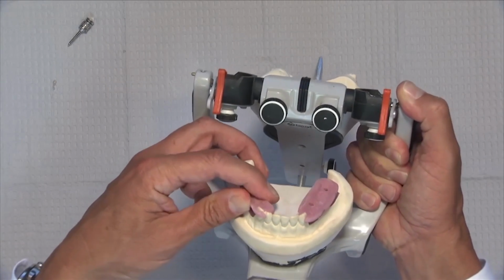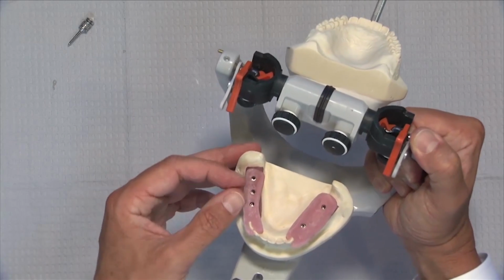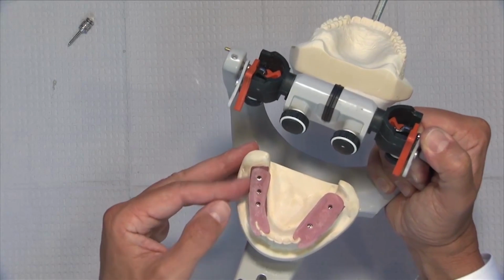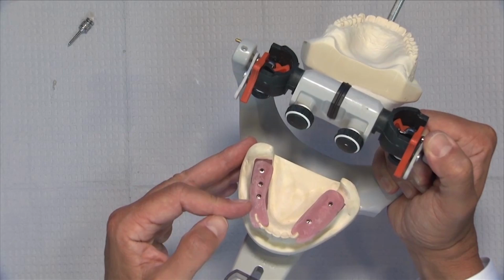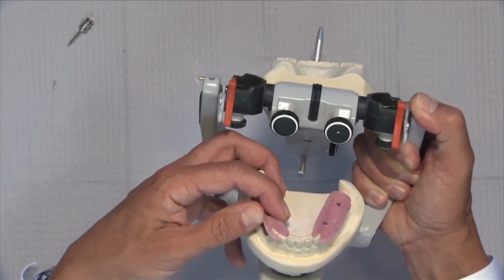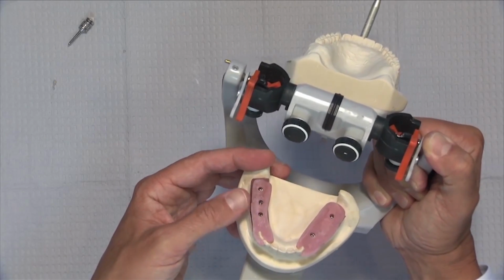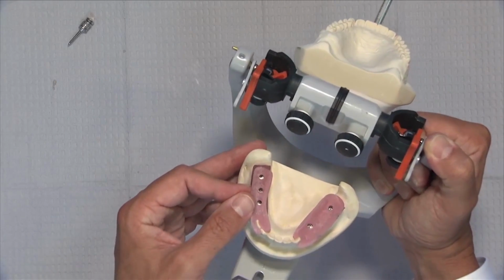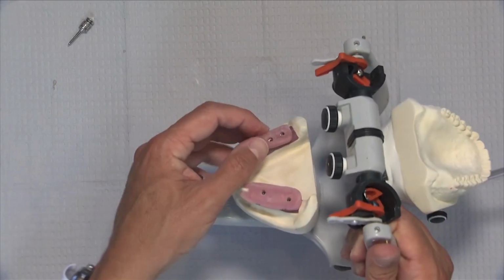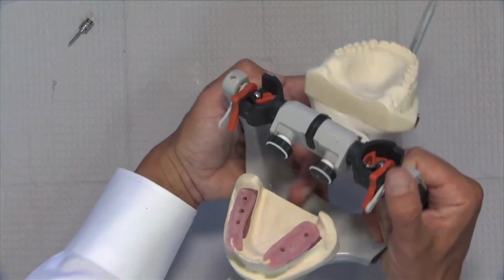When you compare this to a typical bite block that we use in removable or even in crown and bridge, just trying to take a bite registration of an edentulous space, a mush bite as it's sometimes called, this is just a huge jump ahead, light years ahead in terms of accuracy. And you can see why we're hopefully going to need very few adjustments when we go to finally put the case in place, because we've got this nice stiff platform that we're going to use for our bite registration.